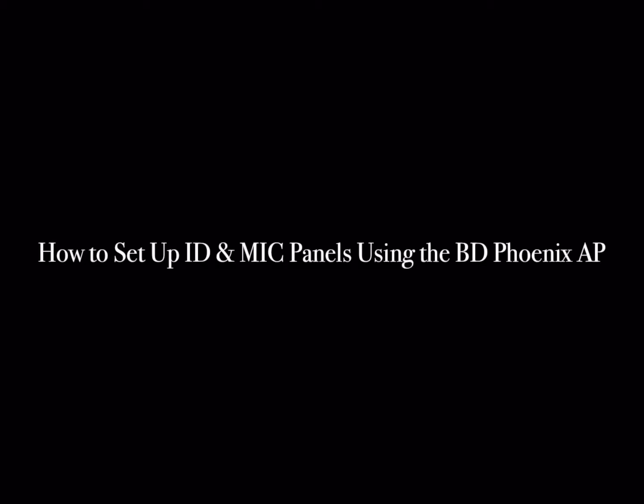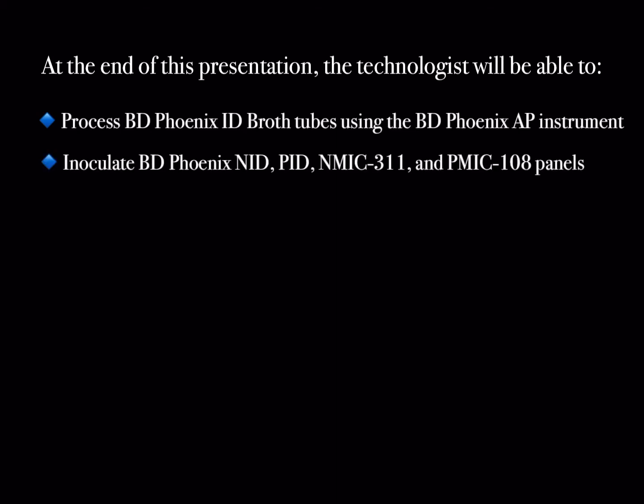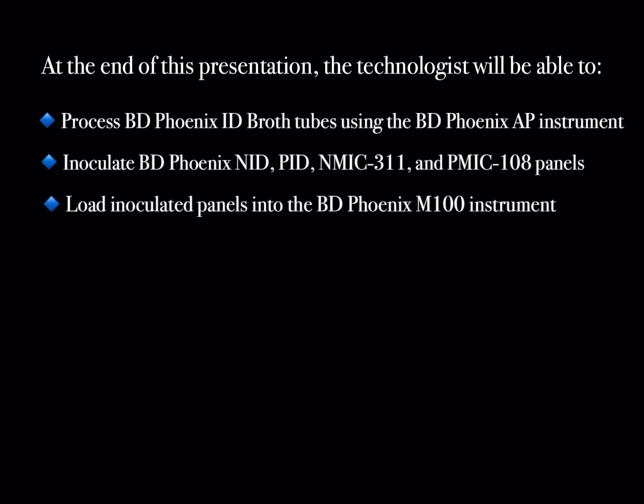How to set up ID and MIC panels using the BD Phoenix AP. At the end of this presentation, the technologist will be able to process BD Phoenix ID broth tubes using the BD Phoenix AP instrument, inoculate BD Phoenix NID, PID, NMIC 311, and PMIC 108 panels, and load inoculated panels into the BD Phoenix M100 instrument.